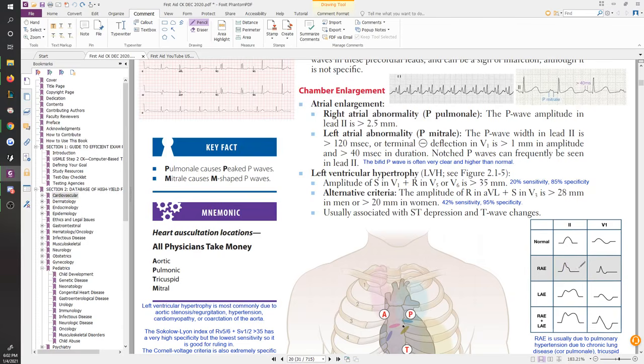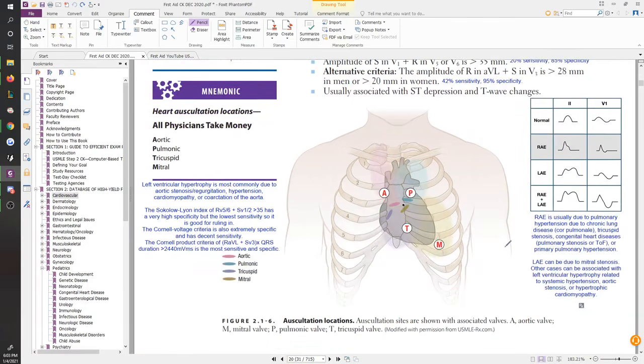But what you're going to notice is this is going to be too tall. It's going to be too tall. So the more concerning factor is how tall is it, right? If it's a very tall P wave, that's P pulmonale for right atrial enlargement. If it's an M-shaped P wave and it's not very, very tall, that's a left atrial enlargement. That's your P mitrale. Mitrale M, easy to catch in that manner. Okay, it's not so bad.